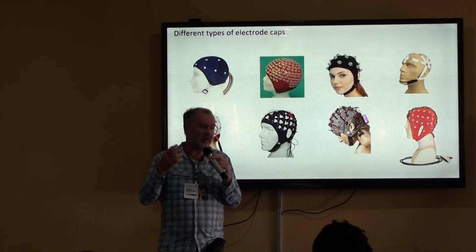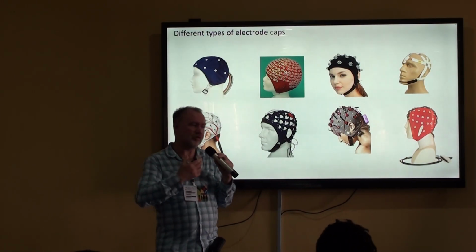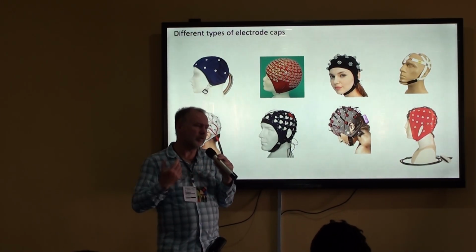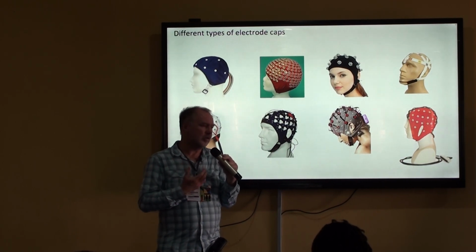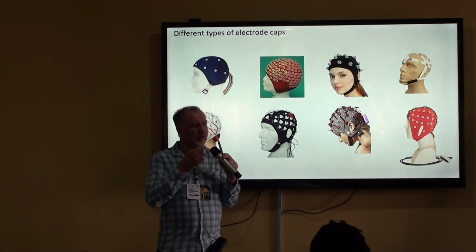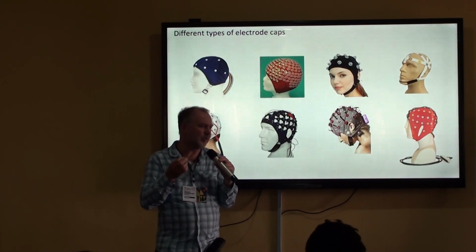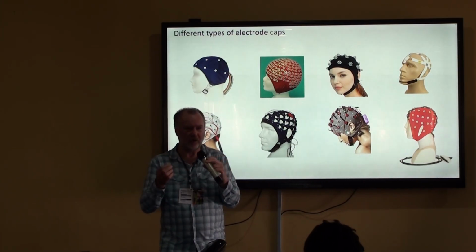Usually, I'm saying that we have normal electrodes, but that's normal because in the research that we're doing at our center, normally we have experimental sessions that last about 1 hour to 1.5 hours. And that's because we're doing a cognitive task, and after 1.5 hours, the participant is really bored with the task. They don't want to do the task anymore.